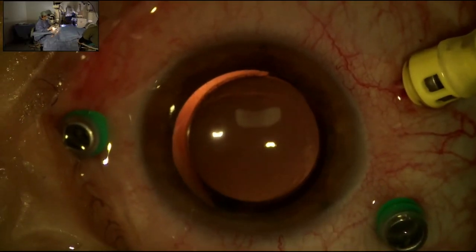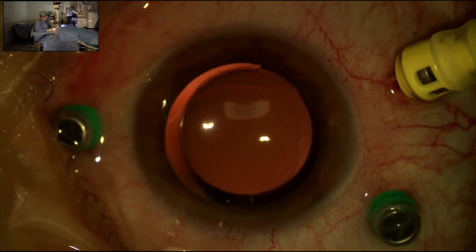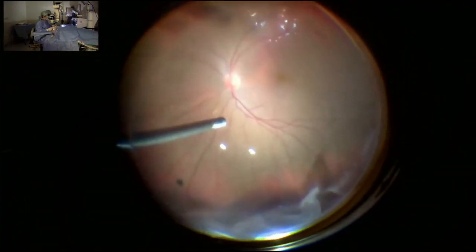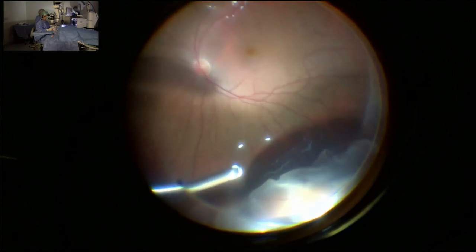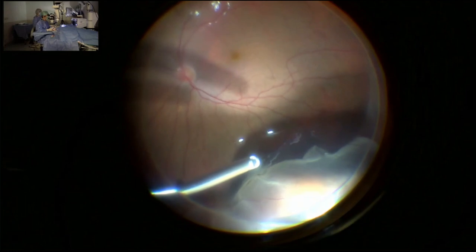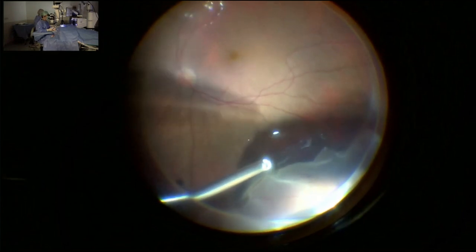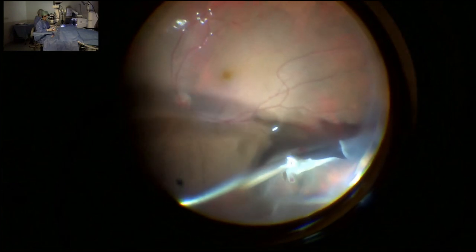Professor, infusion 27 gauge, right? Yes. And incisions for instruments 23 gauge. Yes. And do you feel any imbalance? I mean, maybe a hypotony, because 27 and 23, very interesting combination. So this is a good question. The smart IOP system provides us a stable pressure in the vitreous. Even with 27 gauge infusion with the new trocar system, it really provides enough infusion during this hybrid system. I tested this many times, and therefore there is no problem with smart IOP, the active intraocular pressure system, and with the new trocar system you can do it easily without any hypotony problem. Infusion is enough to keep normal pressure in the vitreous cavity.